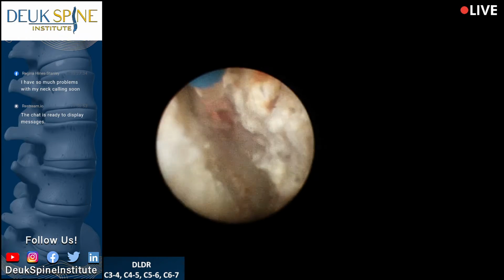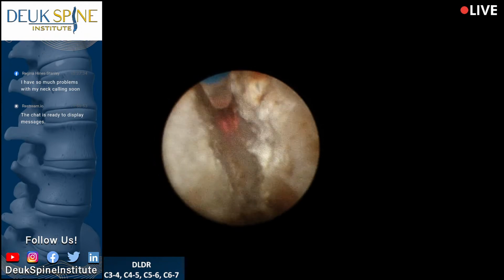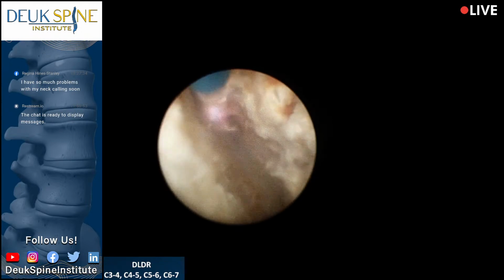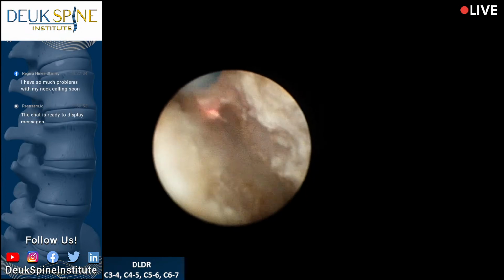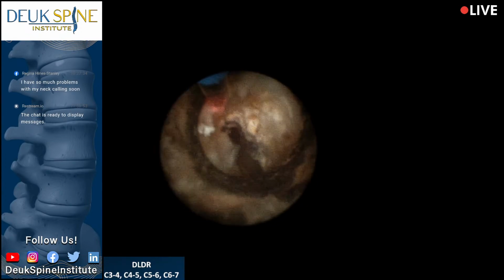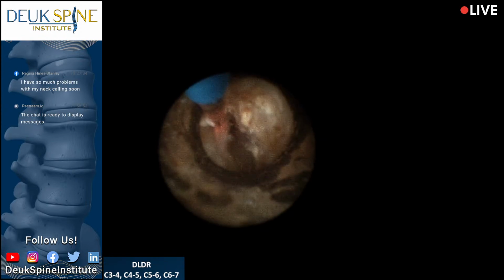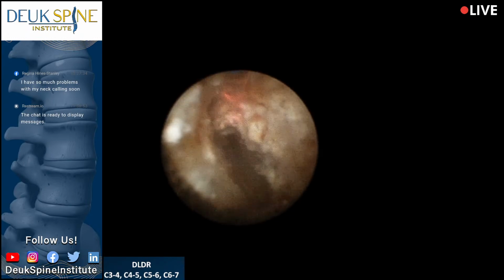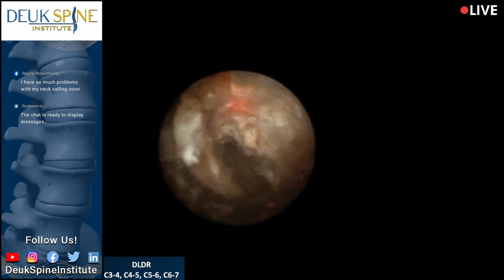Everything okay, Luis? Yeah. Just trying to push it. Luis and I are completely leaning into this. He'll have a little bit of bruising on his chest because we're trying so hard to get everything cleaned out. We don't want to leave anything that might cause problems for him.